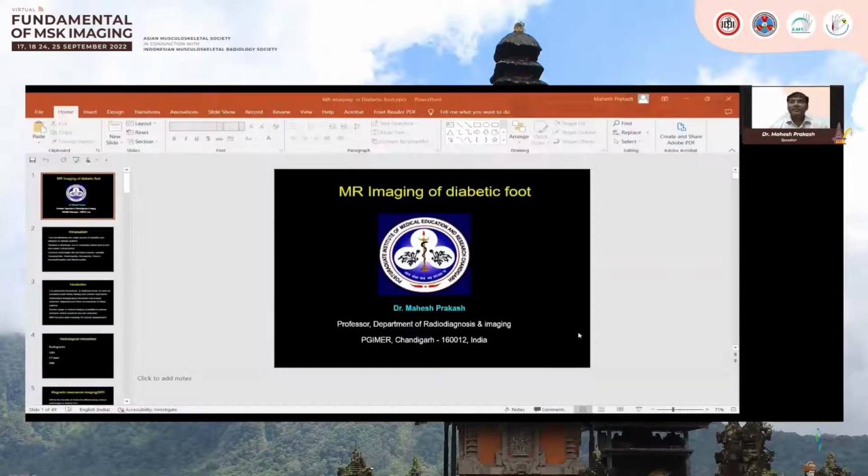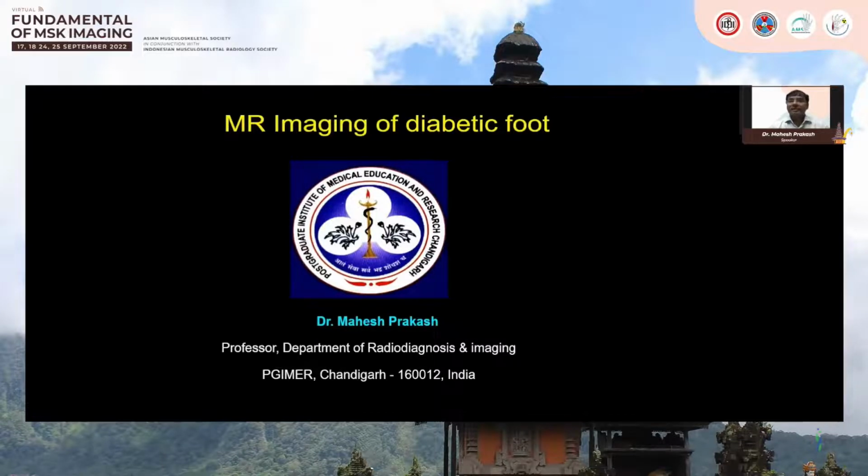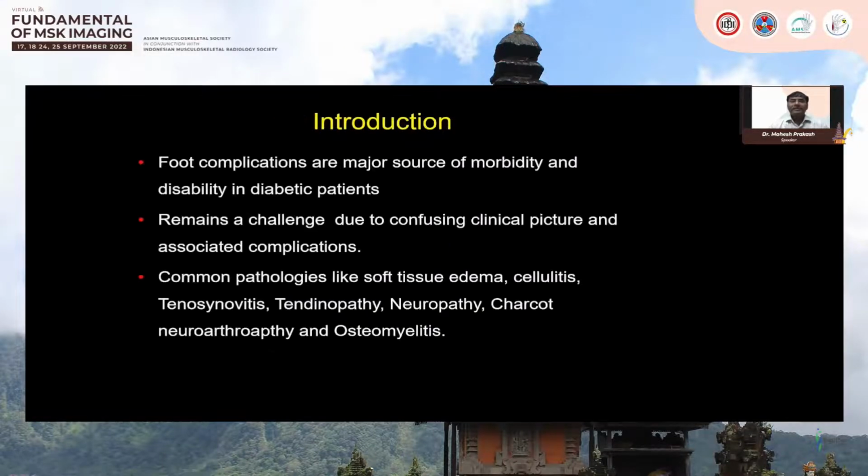Hello everyone, welcome to this AMS scientific session. First of all, I thank the organizing committee of the AMS for providing me this opportunity. My topic is the MR imaging of diabetic foot. As we know, diabetes is a very chronic disease and affects various organs of the body. The foot complications are the major source of morbidity and disability in these patients. The complications remain a challenge because of the confusing clinical pictures associated with them in diabetic foot.